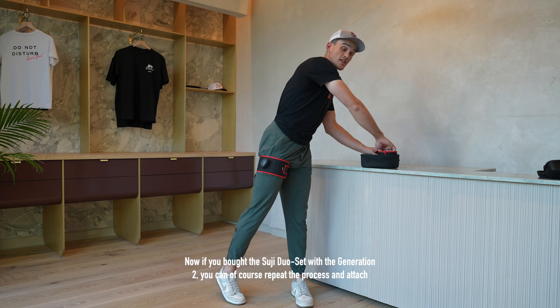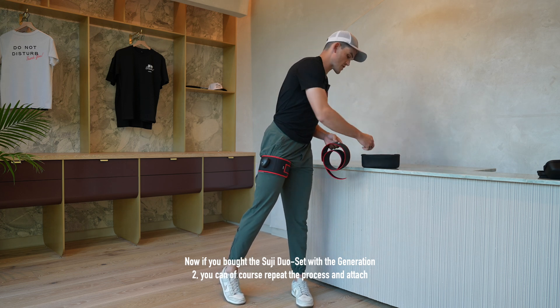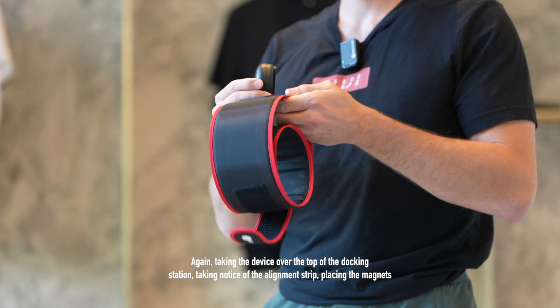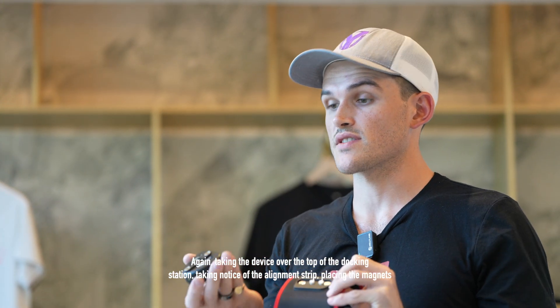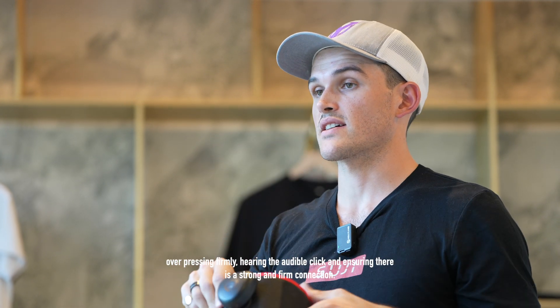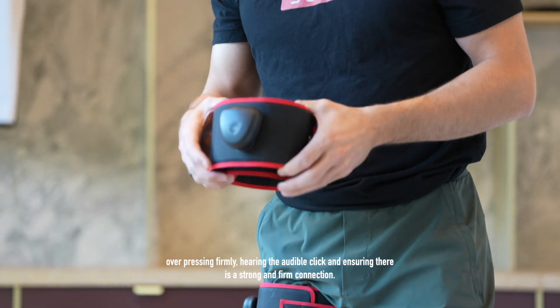Now, if you bought the Suji Duo set with the Generation 2, you can of course repeat the process and attach the second compression garment. Again, taking the device over the top of the docking station, taking notice of the alignment strip, placing the magnets over, pressing firmly, hearing the audible click and ensuring there is a strong and firm connection.